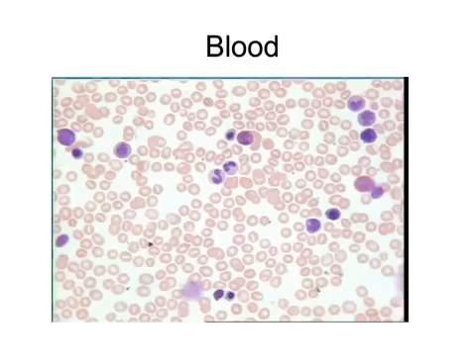Besides the erythrocytes, we also have our leukocytes. The leukocytes are the white blood cells, and our leukocytes are indicated by all these purple cells. There are various types of leukocytes that we will be looking at. Now you'll notice that each one contains a nucleus and a mitochondria, and it's going to be the shape of the nucleus that we will use for classifying our various types of white blood cells.